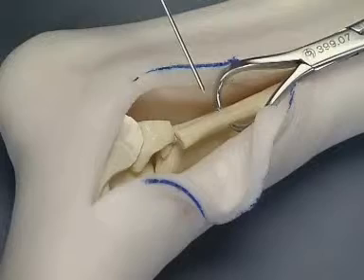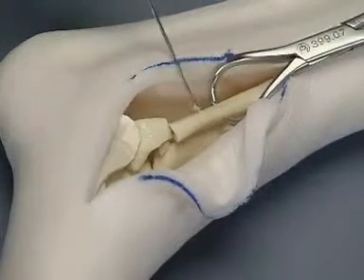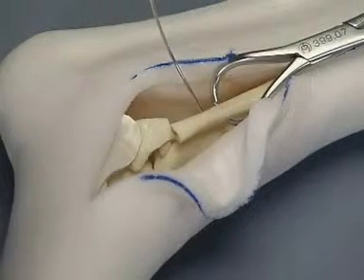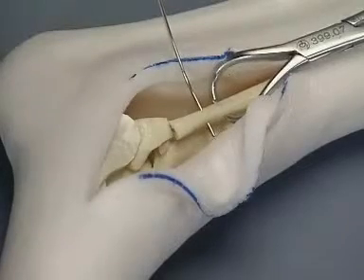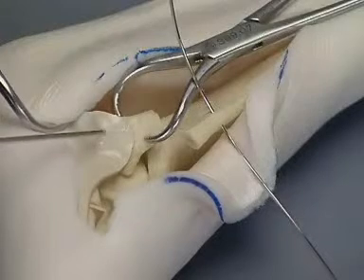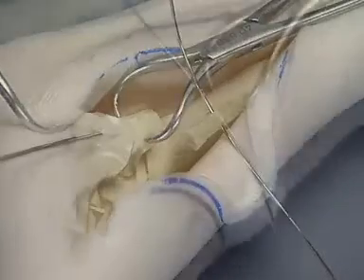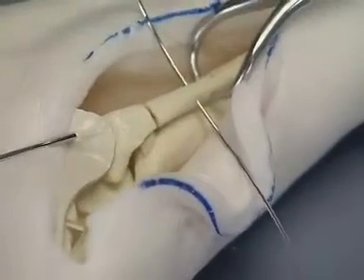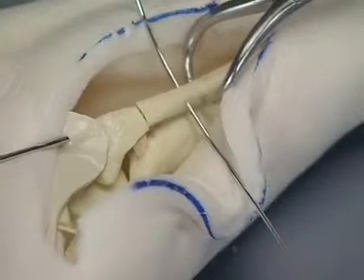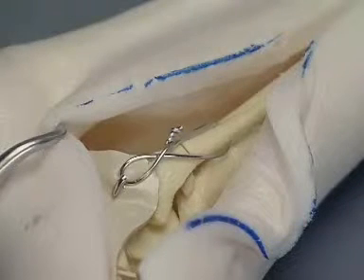A hole is drilled with a K-wire through the fibula one centimeter proximal to the fracture. A strand of wire is placed through the hole. A K-wire is inserted starting at the malleolus and exiting at the fracture. The fracture is reduced and the wire is driven proximally. The figure-of-eight wire is secured to form a tension band.